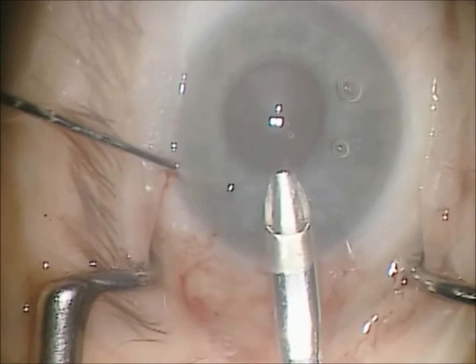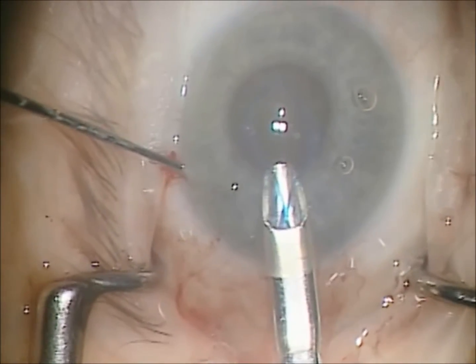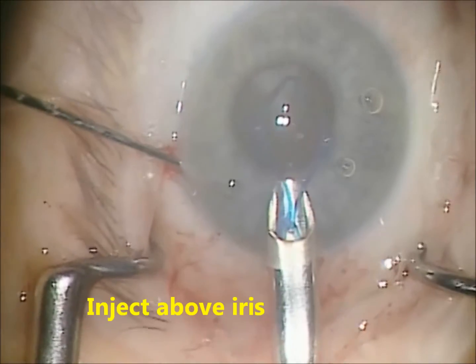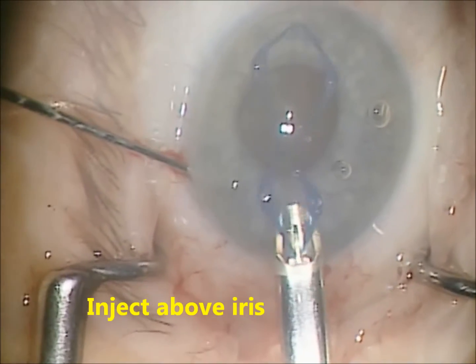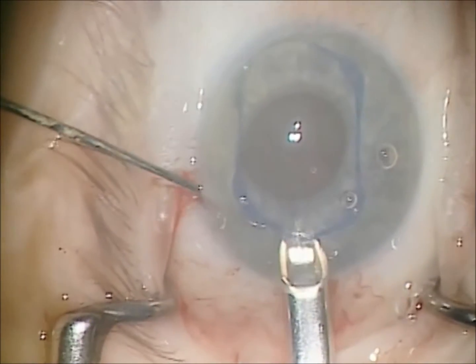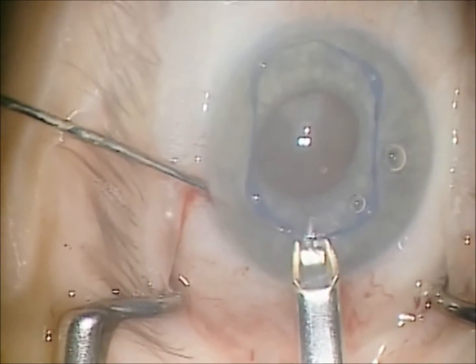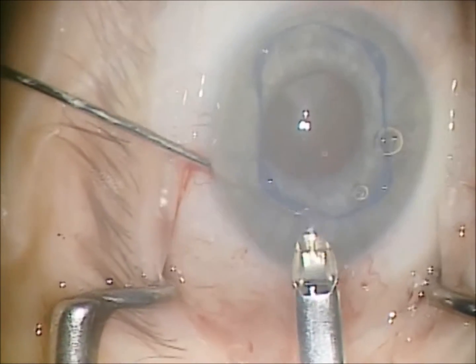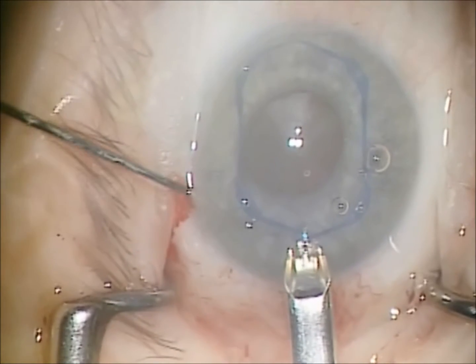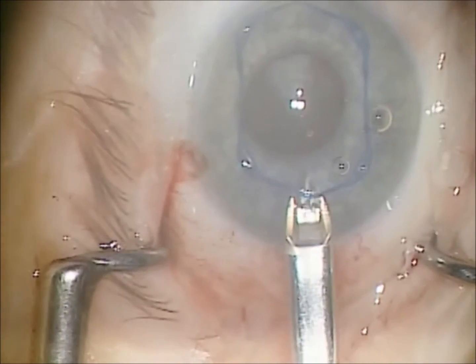The entire dilator is injected above the iris into the anterior chamber. Make no attempt to engage the iris at this point. The injector is then brought below the dilator and brought out of the eye.